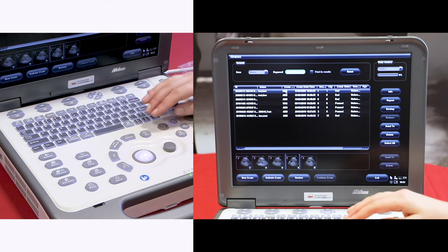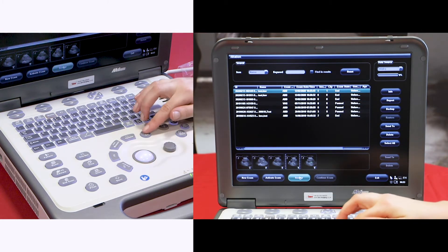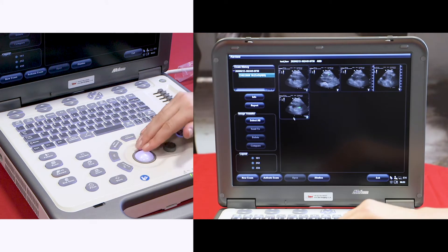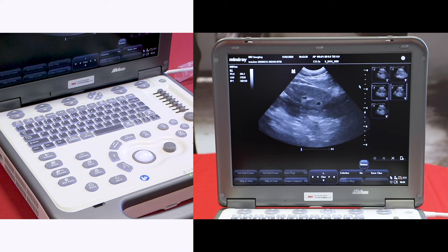To review any images, highlight the exam you want to review and come down to the review button. If you double-click with the set button on any of your images, it will come into full screen.